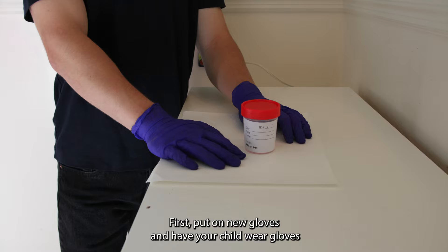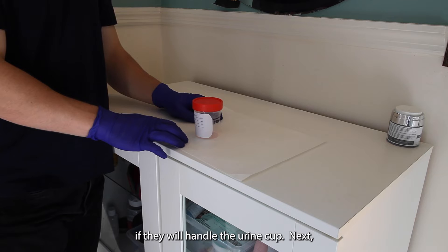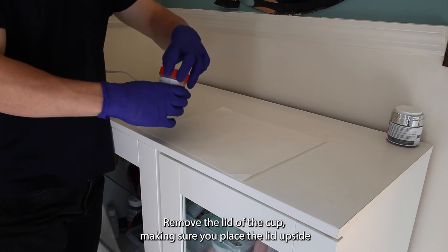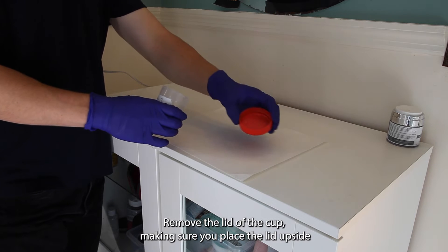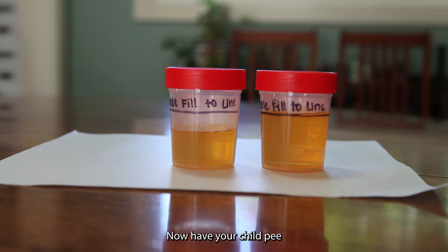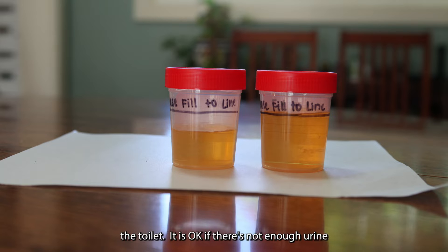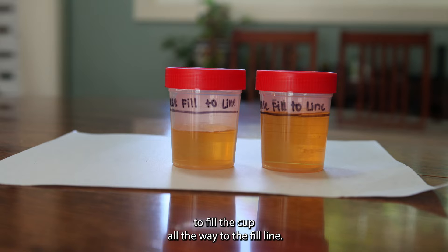First, put on new gloves and have your child wear gloves if they will handle the urine cup. Next, remove the lid of the cup, making sure you place the lid upside down on the napkin. Now have your child pee into the cup and stop when the urine reaches the fill line. They can finish peeing into the toilet. It is okay if there is not enough urine to fill the cup all the way to the fill line.